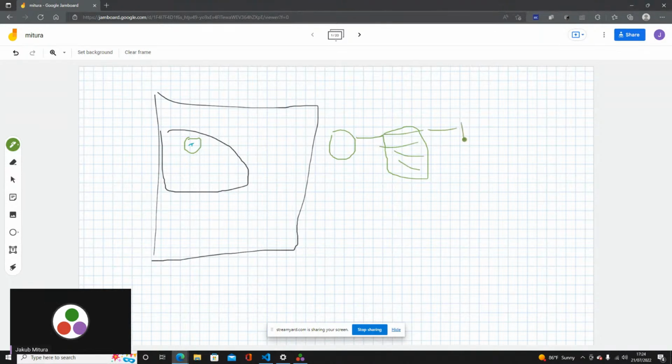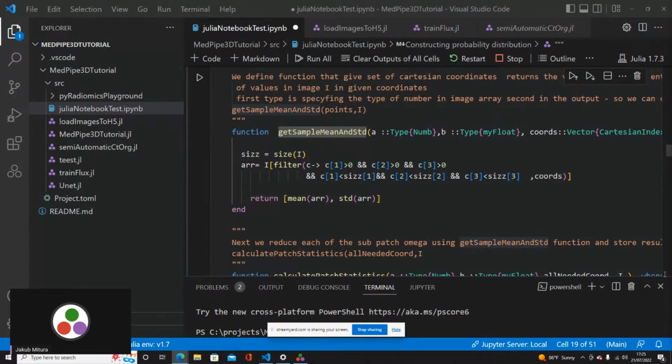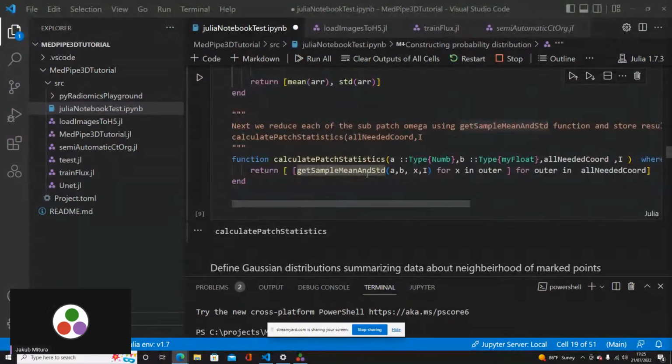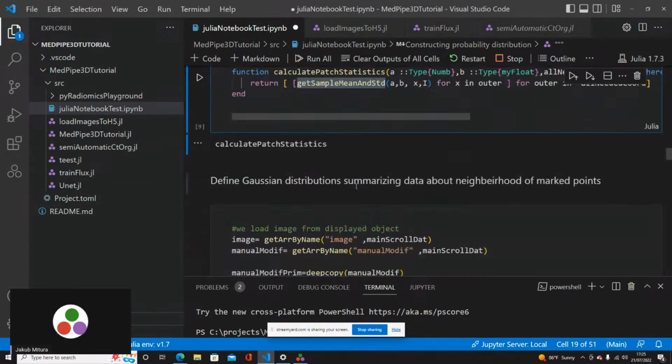From it we get the mean and the standard deviation: we take the variance and then square root it. But the important idea is that we get the patch that is the representation of the data here. Are there any questions? No. Okay. And this is what is happening in this get sample, mean, and standard deviation function.